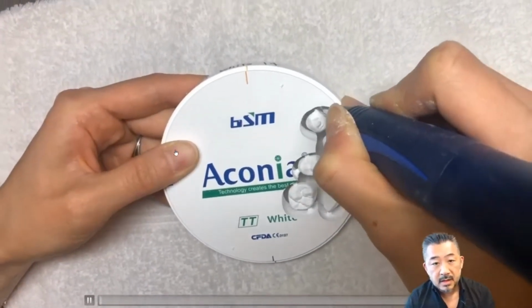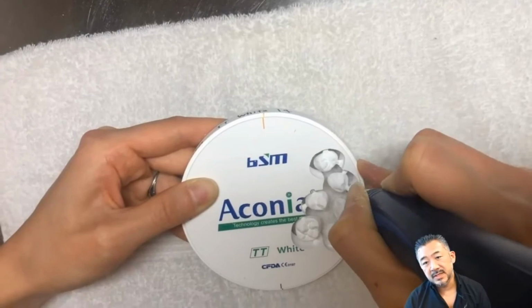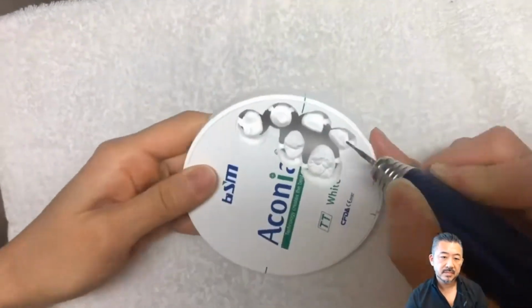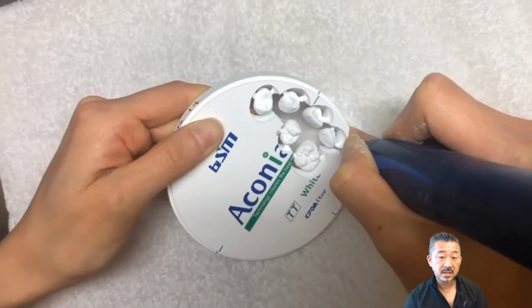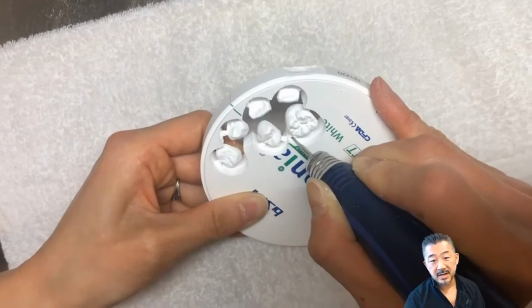Okay, let's remove the crown from the disc. So gradually cut the connector from both sides of the disc to prevent the crown from chipping. So do it carefully. So you can see the crown incisal and the occlusal facing the surface of the zirconia, right?